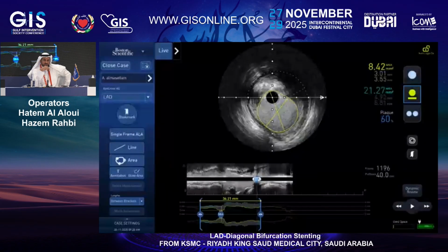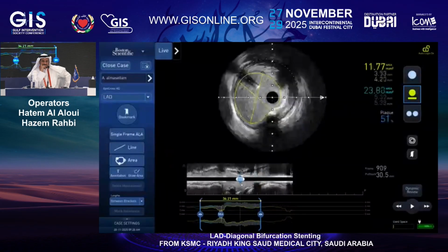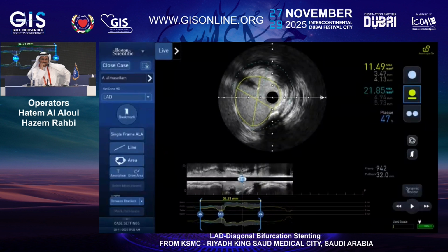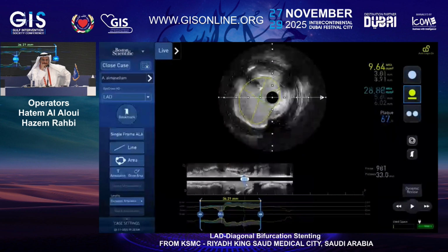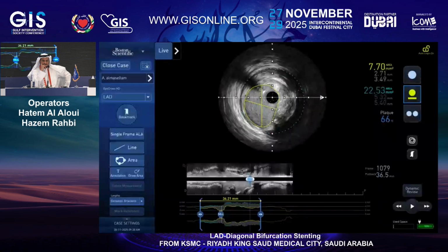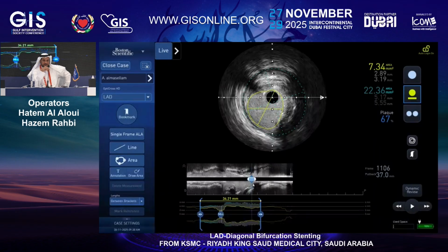Or the other option for us was to try to be very short with the POT and land somewhere there. But that will mean we're going to have to ignore this disease, which, as you said, may get exaggerated once you stent.